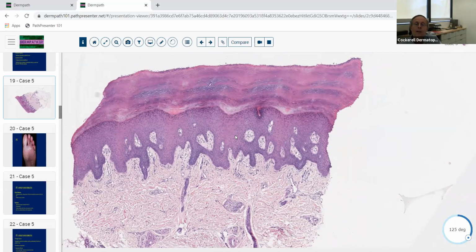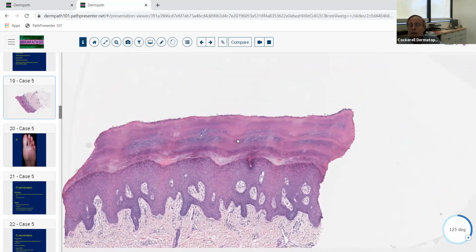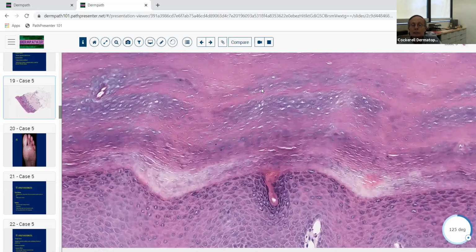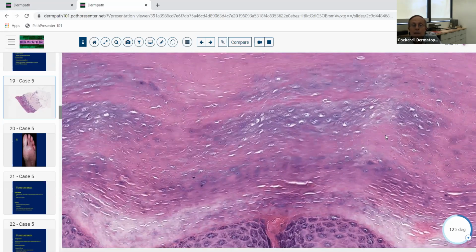So make sure there's no fungi in there. A lot of times you get biopsies from volar skin to rule out melanoma and it's tinea nigra. You want to make sure there's no bacteria in the cornified layer. Make sure there's no chemical application in the cornified layer. A lot of times you get people that use henna dye tattoos. You can actually see that under the microscope. It's a blackish brown material that deposits on the surface of the stratum corneum, or silver nitrate. So let's see if we see any evidence of tinea nigra, which doesn't look like there is anything here.